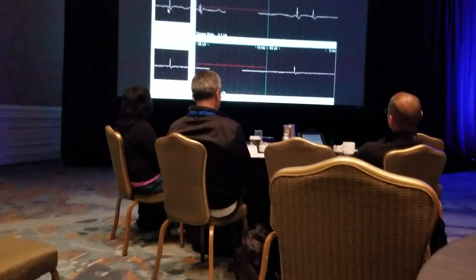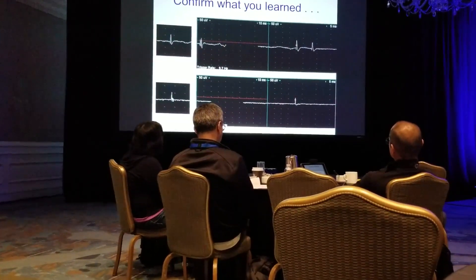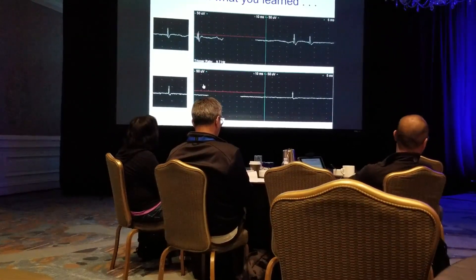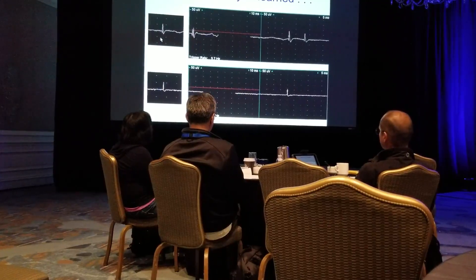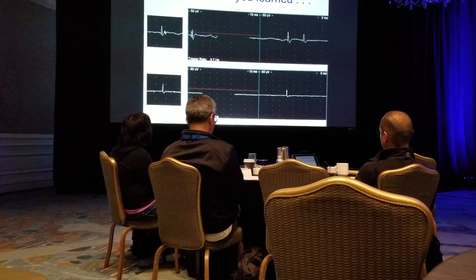This is a triphasic end plate spike. This is a biphasic fibrillation. You cannot tell what they are by looking at them. Even though most end plate spikes will be biphasic negative, here's an example of one that's not.